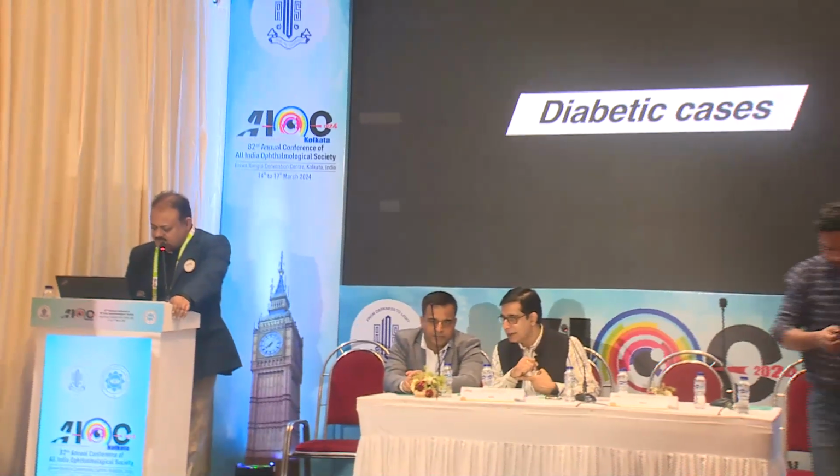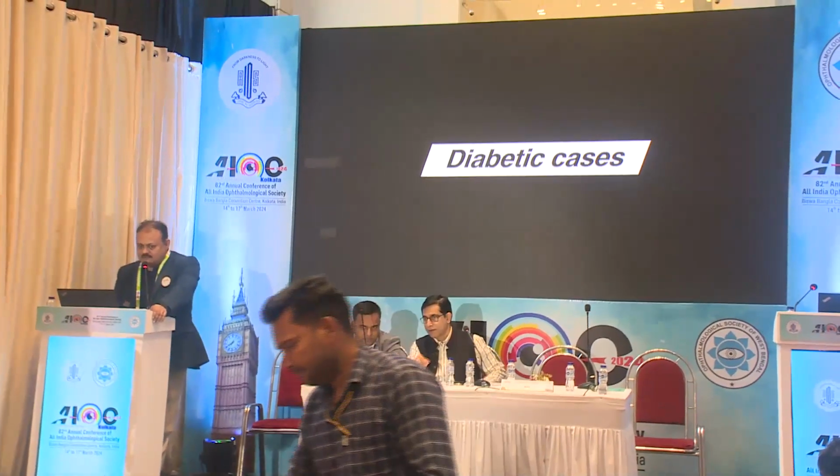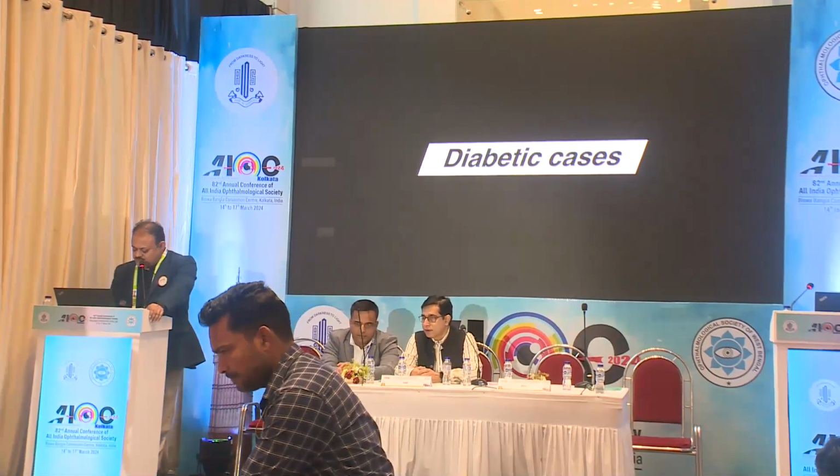Thank you. Well, I will be showing you iatrogenic breaks and how to prevent them. Let's see a few cases where this iatrogenic complication has happened, and then we will have videos on how to prevent this.